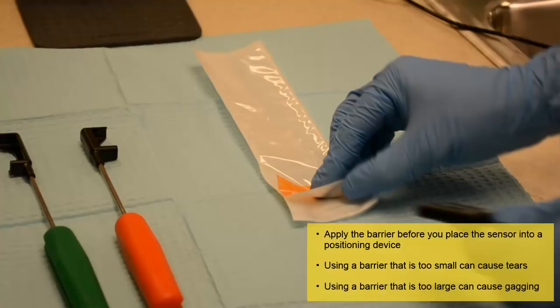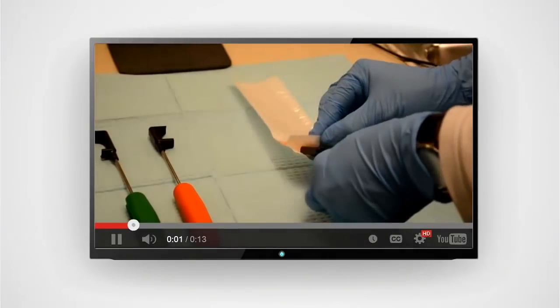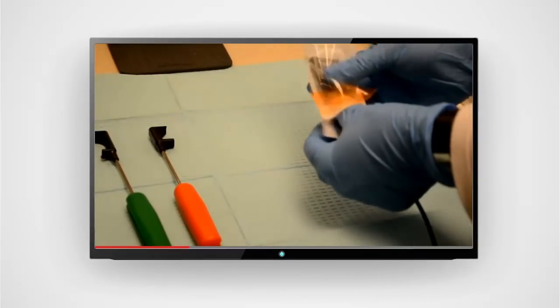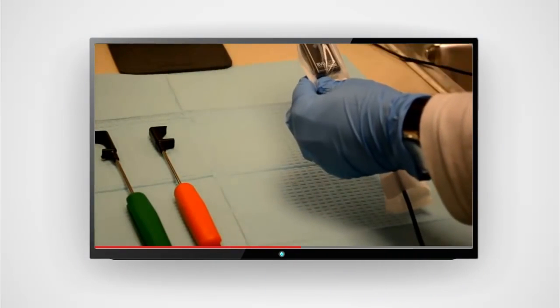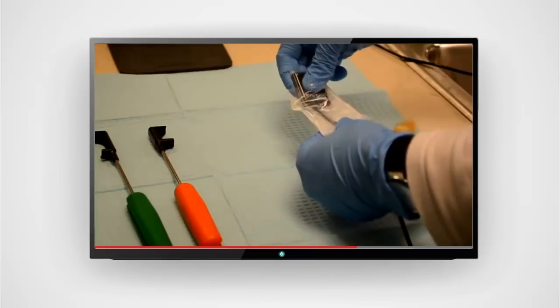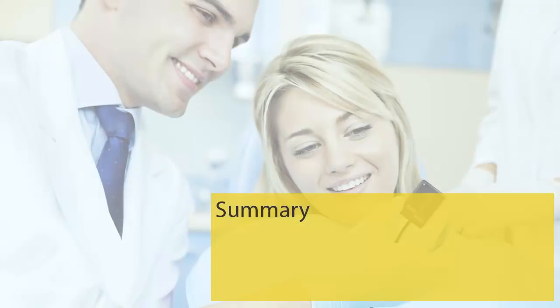Quick Tip: using a finger cot on top of the barrier can help prevent tears during the x-ray exam. After you select the barrier, slide the sensor into the barrier. Make sure that the barrier slides all the way down on the sensor. If necessary, use your thumbs and forefingers to push the sensor to the end of the barrier. You should now be able to define Direct Digital Radiography, identify the RVG sensors, and prepare the sensors for use.